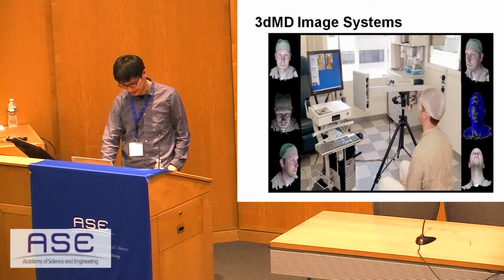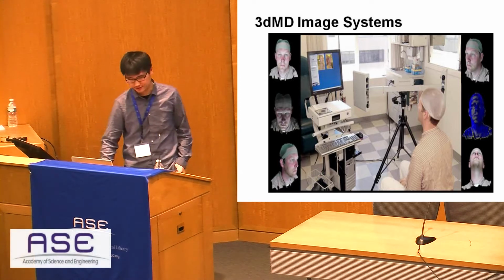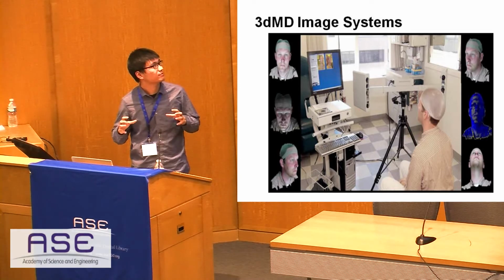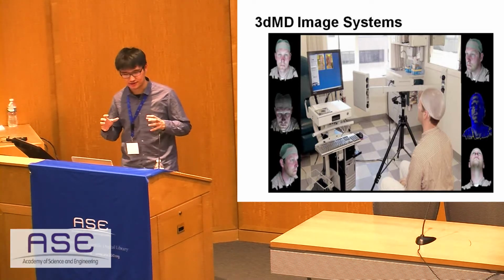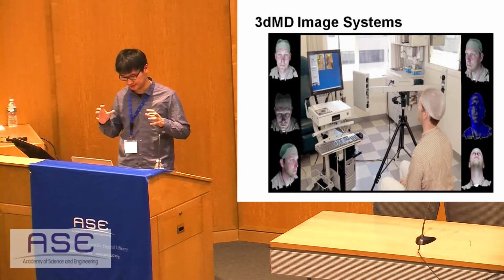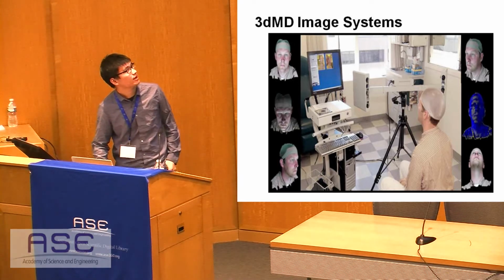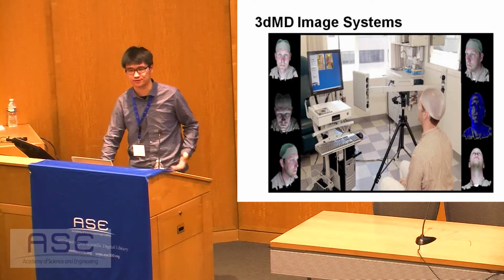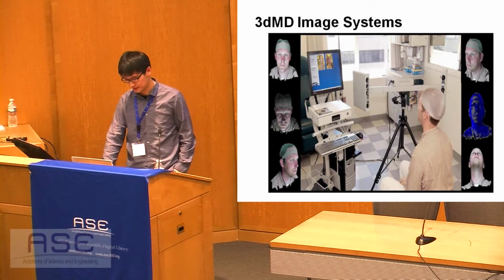Another thing I want to mention is that for this system, taking this kind of 3-dimensional photo is less harmful than using a CT scan. There's no radiation, which is very good because the baby is very sensitive.